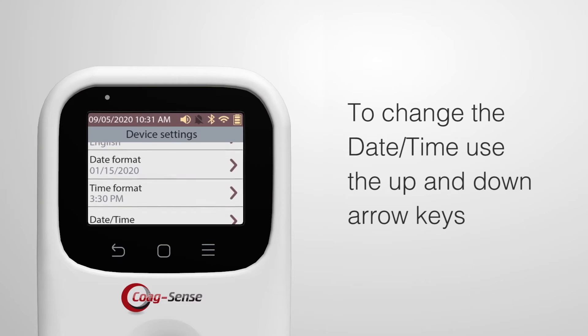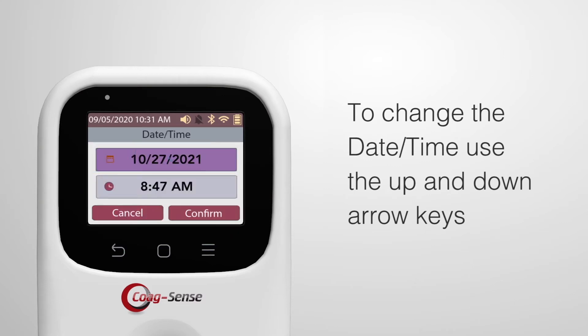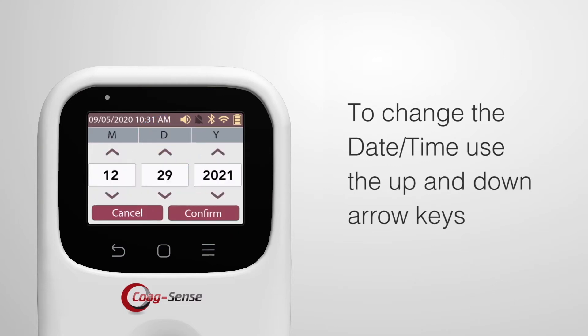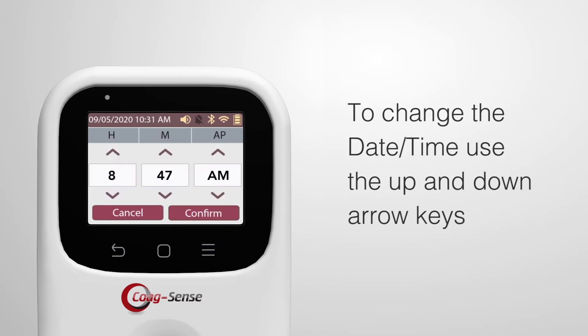To change the date time, use the up and down arrow keys to get the appropriate month, day, year, hour, minutes, AM, PM, then confirm.